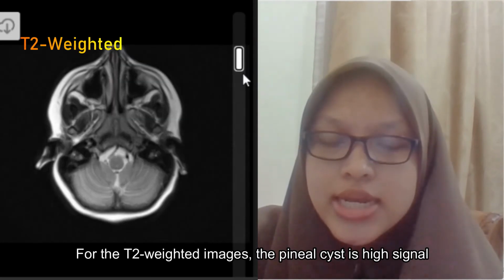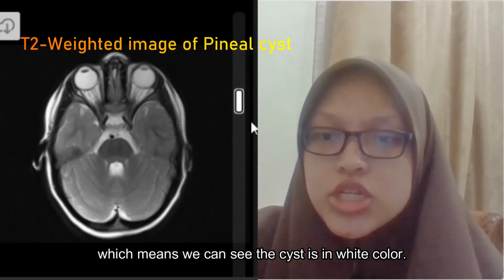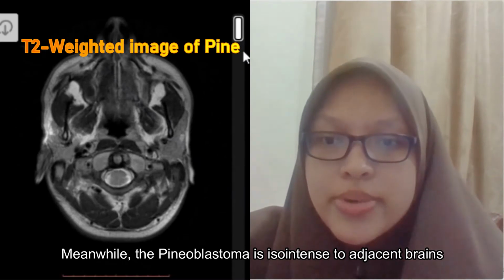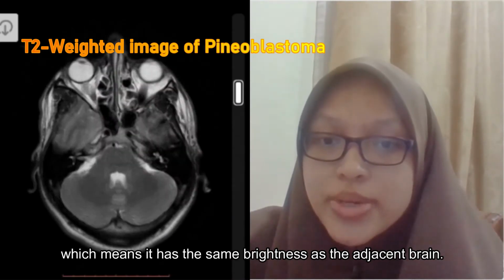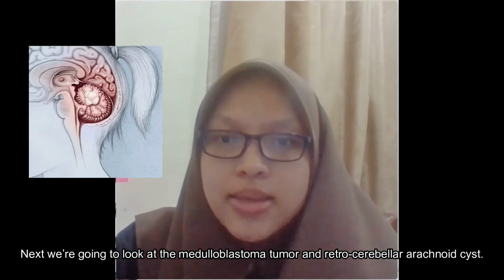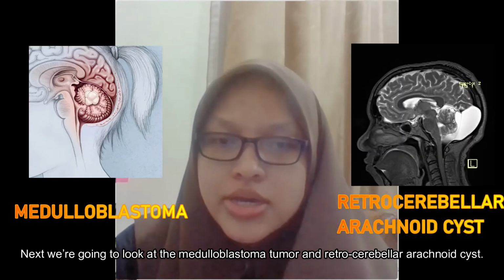For the T2 weighted image, the pineal cyst is high signal, which means we can see the cyst is in white color. Meanwhile, the pineoblastoma is isointense to the adjacent brain, which means it has the same brightness as the adjacent brain. Next, we are going to look at the medulloblastoma tumor and the retrocerebellar arachnoid cyst.